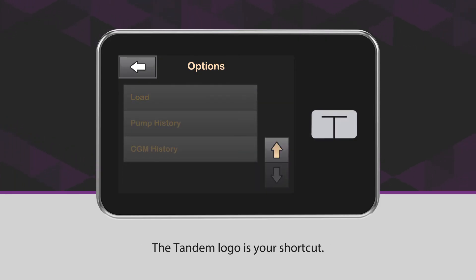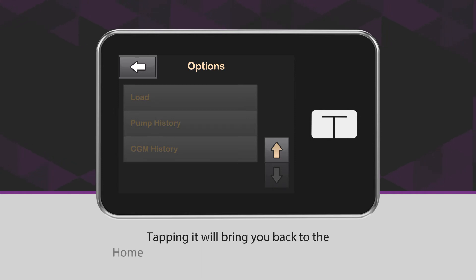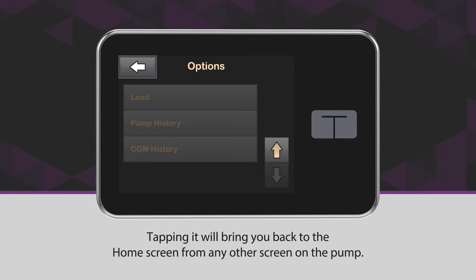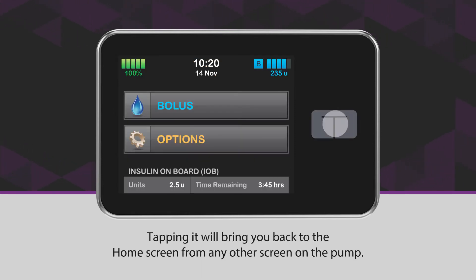The Tandem logo is your shortcut. Tapping it will bring you back to the home screen from any other screen on the pump.